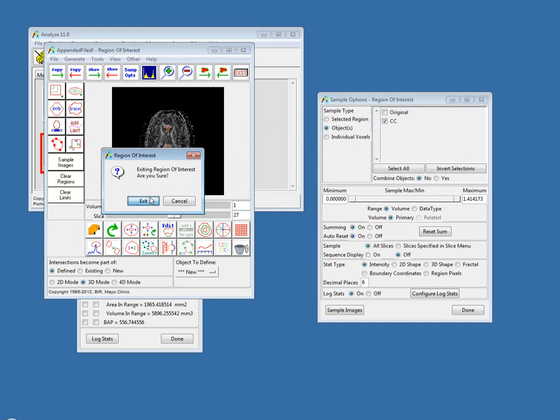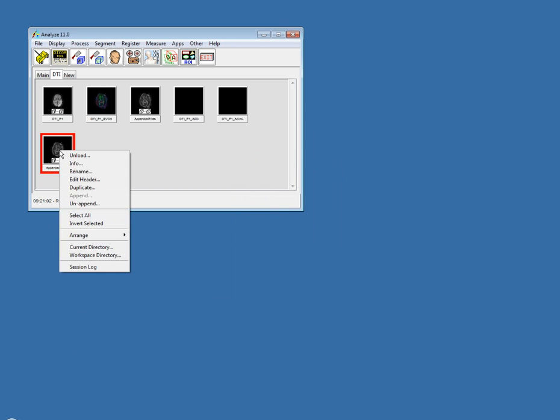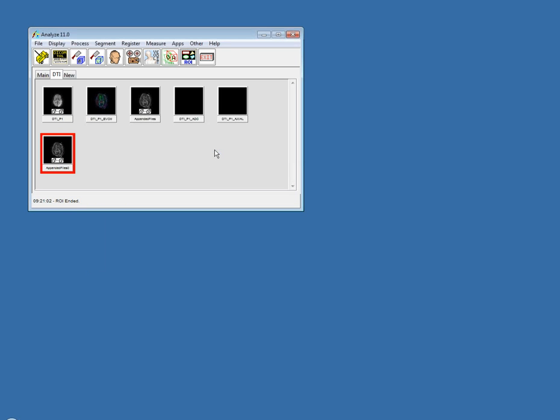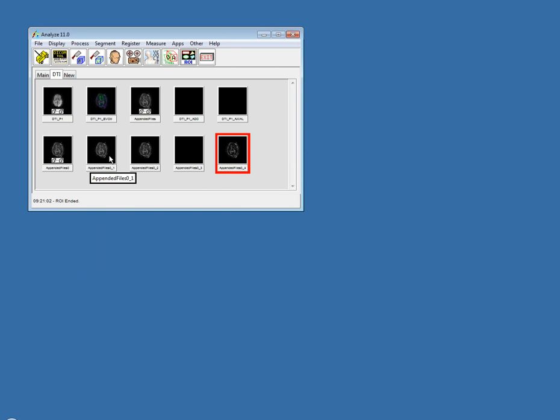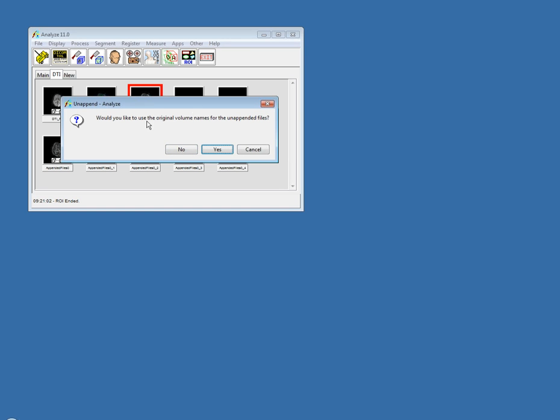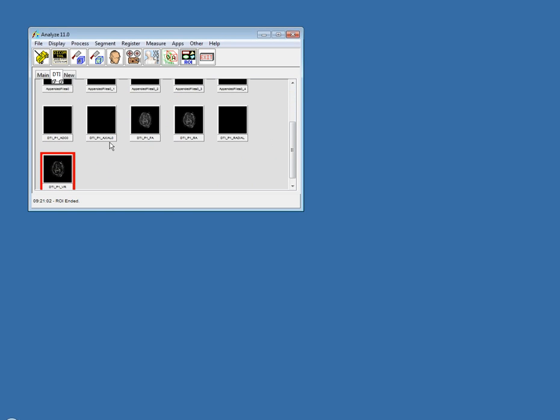Another option related to multi-volumes is to unappend and retain the original volume names. If I right-click on my appended files and choose unappend, choosing don't unload — with the original file it should retain the original volume names. It did ask me if I wanted to use the original volume names. I click yes, and you can see those original volume names were retained.